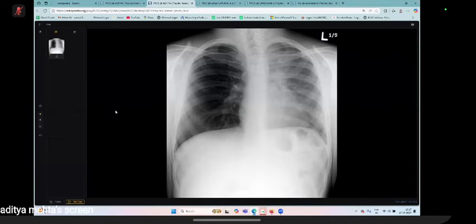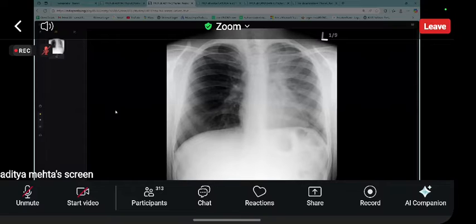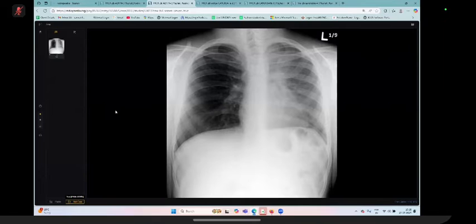like to know if there have been any previous episodes, or if this is the single episode after which the child has presented with this case scenario. My concern in this age group is that if there is an acute presentation, it could be a case of foreign body inhalation, which has been stuck. And for that, I would like to take the decubitus views in both lower positions, like the left lower decubitus view and the right lower decubitus view.